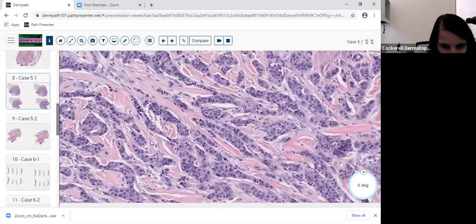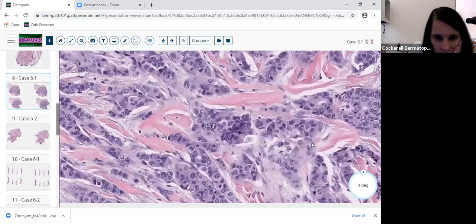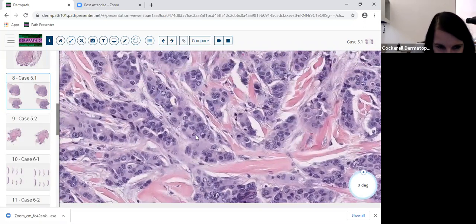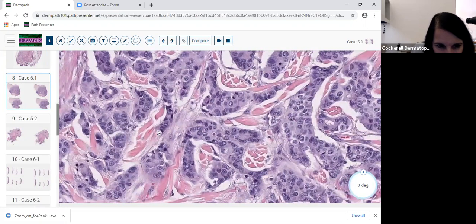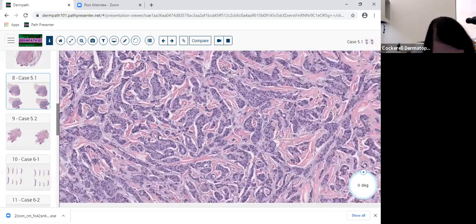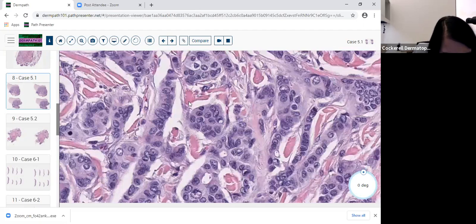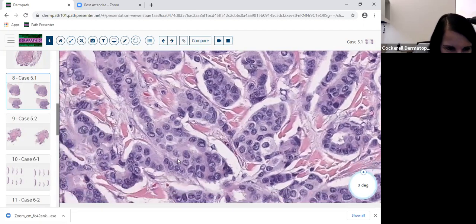So now the question is, is this a squamous cell? Well, I don't see keratinization here. I'm looking around and I don't see intercellular bridging to see the differentiation that you would see in a squamous cell. Don't confuse this collagen for keratin. Don't make that mistake. Also, we don't see melanin in these cells. You have to look in these cells for melanin to say, well, could this be some kind of melanoma? No, this doesn't look like a melanoma.